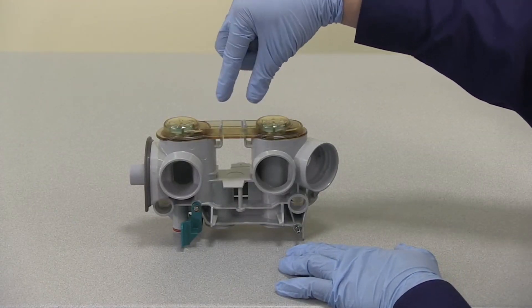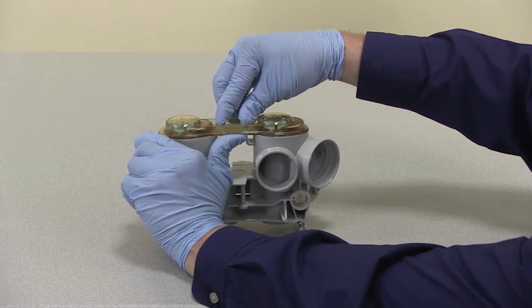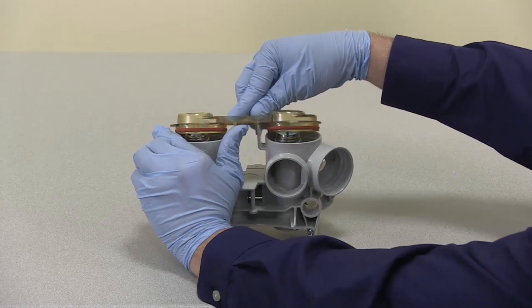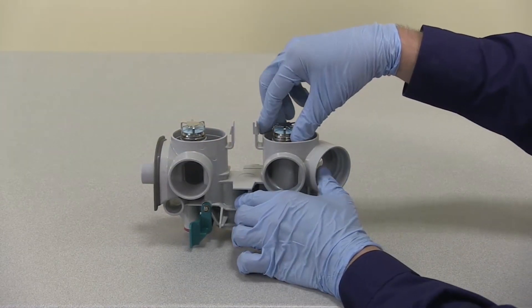To disassemble the breathing circuit module, remove the check valve circuit lens by squeezing the latches together and pulling up on the lens. Lift out the check valve assemblies.